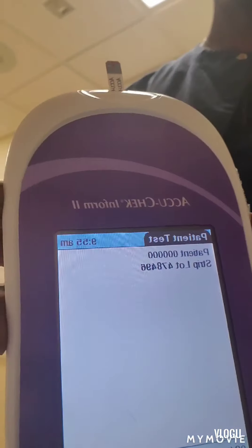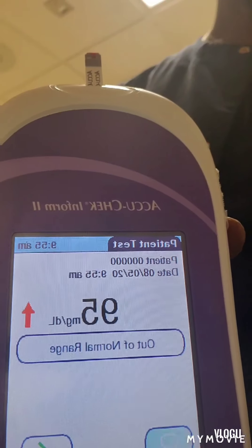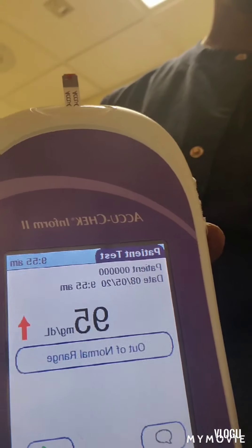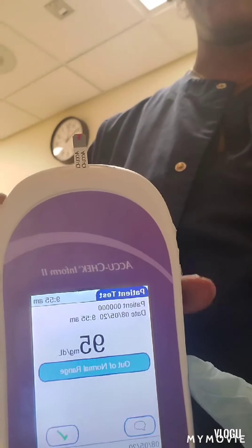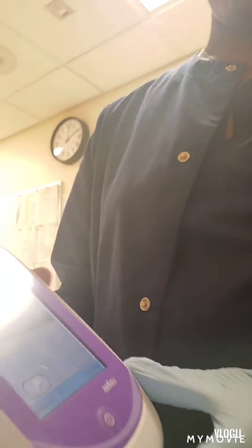We're going to milk it a little bit so that the blood comes out. Then we take our device and apply that drop of blood to the test strip. As you can see, the machine is reading the results. My blood sugar is 95, which is perfectly fine. It's saying out of normal range — that's because I ate, but my blood sugar is fine.